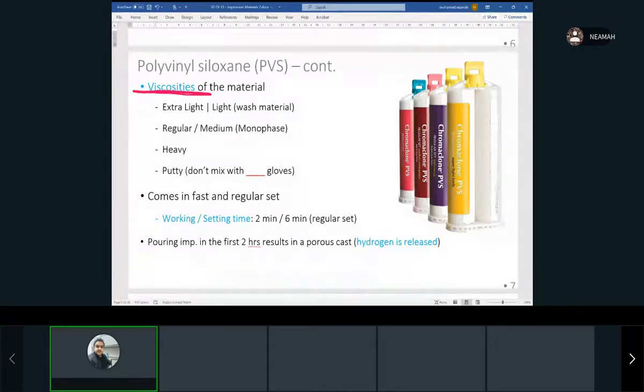They are making some alginate that has two viscosities, one that is a little bit thicker and one a little bit thinner. Let's see, just in case there's something.